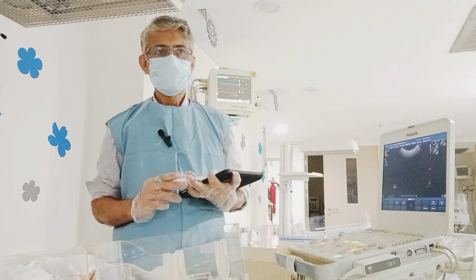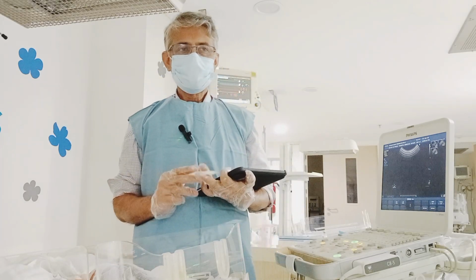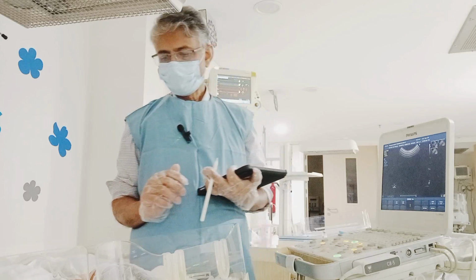Objective assessment of sickness in neonates using sonography. So today's lesson is how to perform lumbar puncture using bedside ultrasound.